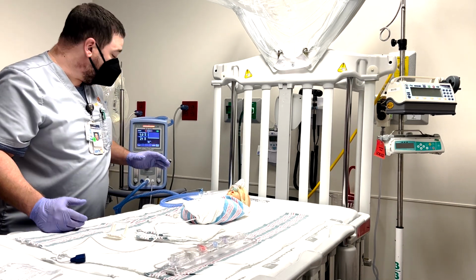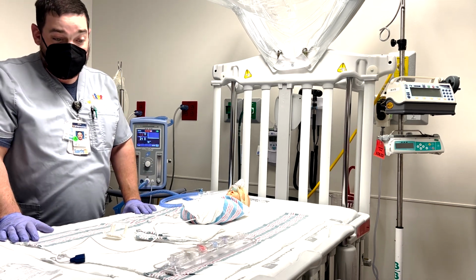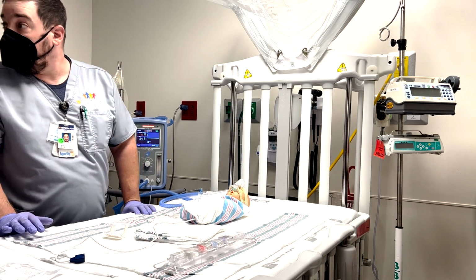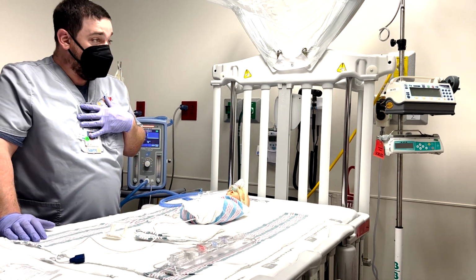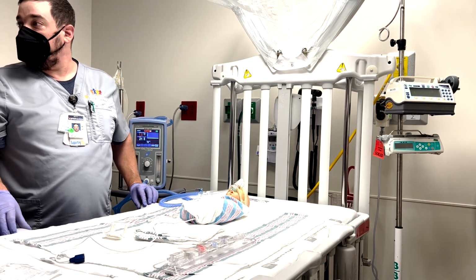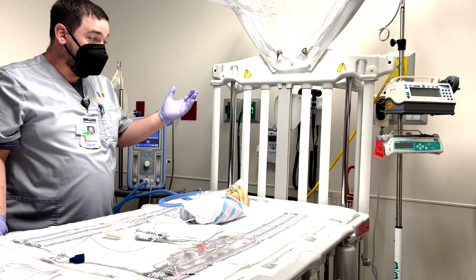So as a result, when it comes to what our upper limit would be, I would have a patient on a PEEP of no more than 7, personally. And that's just my preference. I see Joe nodding in the corner there. Your guys' expertise here. Yeah. So it's again, a personal opinion of mine.